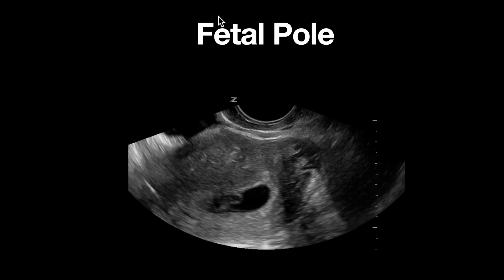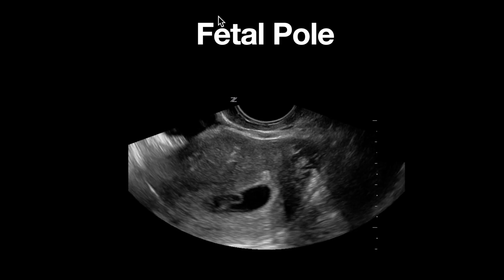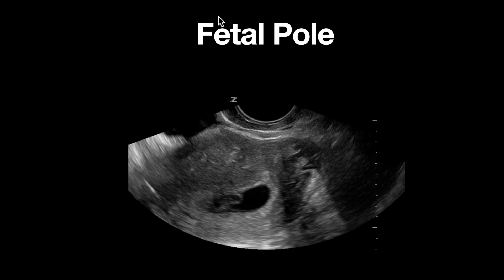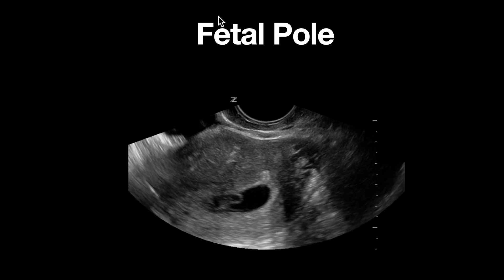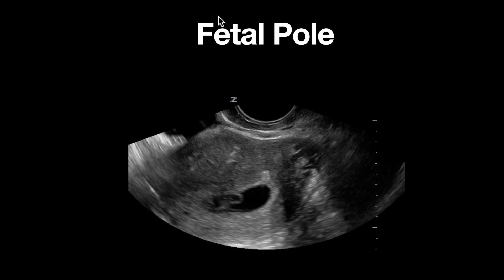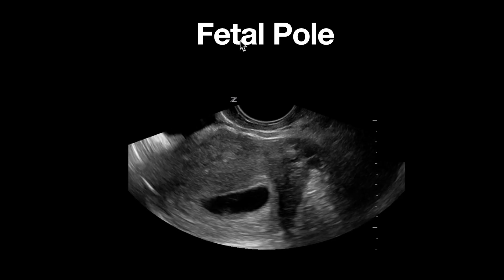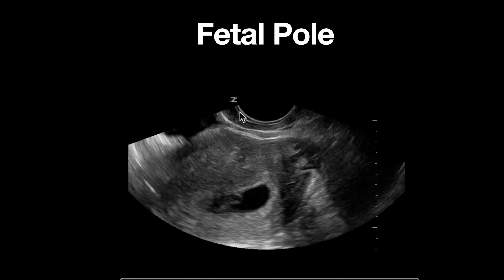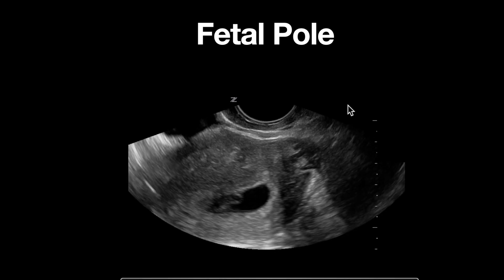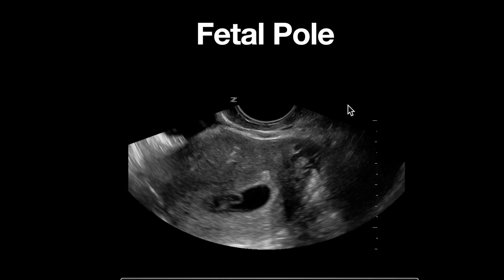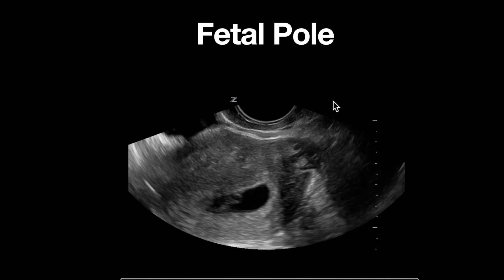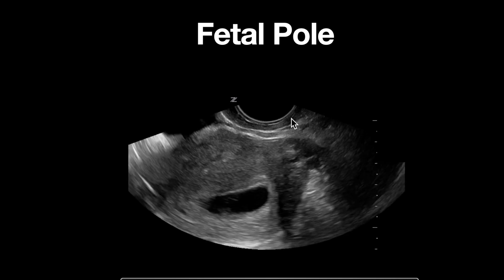This is an ultrasound clip demonstrating an intrauterine pregnancy with the presence of both a fetal pole and a yolk sac. An endocavitary probe is used, as delineated by the semicircular shape of the footprint at the top of the screen. Based on the structures we're seeing, this is a transvaginal view of the uterus in a near sagittal orientation.